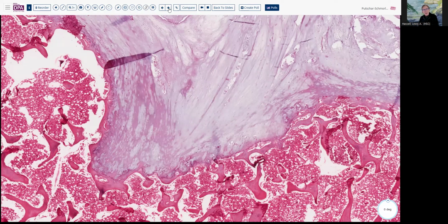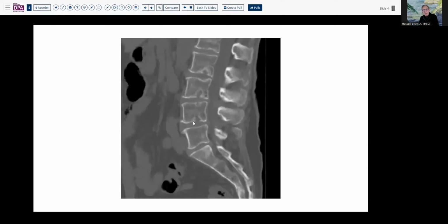So this has been described and localized on radiographs from time to time. Here you see a case where multiple intervertebral discs were involved, and there was a degree of bony sclerosis in response to this degree of herniation, but sometimes it's formed this very nodular appearance, and so was initially described as a node. In fact, this goes under the eponym of Schmorl's node.